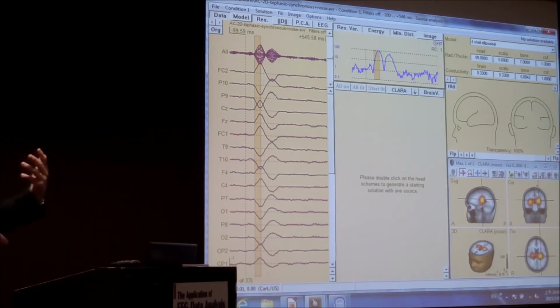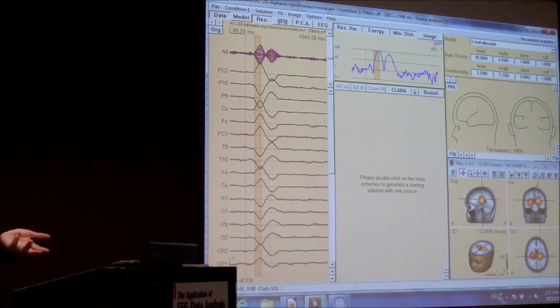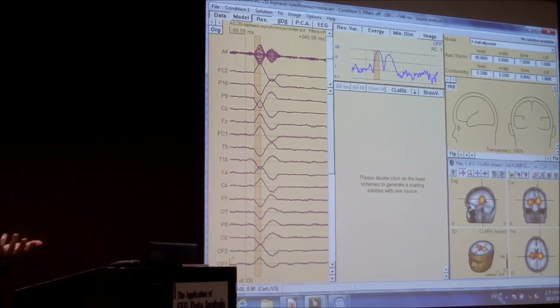But you can take the Loretta method sometimes very nicely in epilepsy diagnosis, if it comes to focal temporal epilepsy or something like this. So this method is also pretty good. But some other methods will be completely failing during that time. So it's difficult to say, Loretta, take it for whatever. It's difficult.